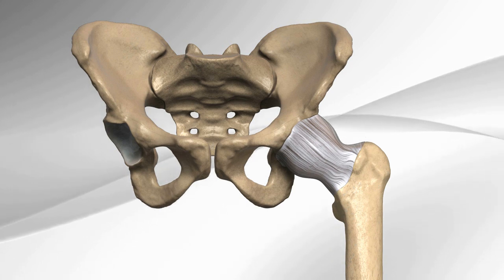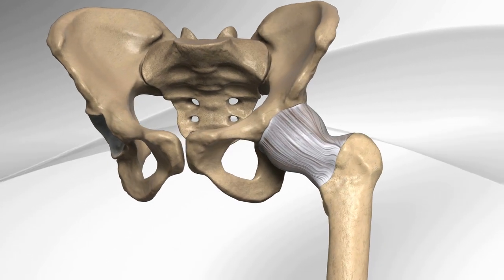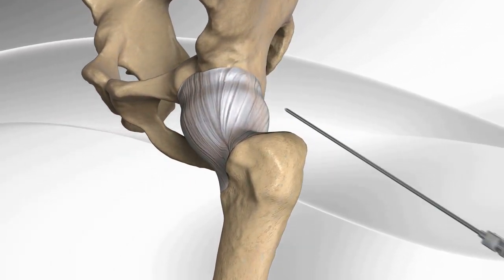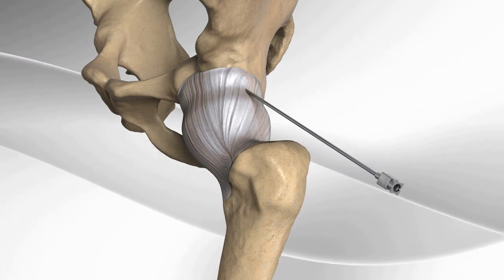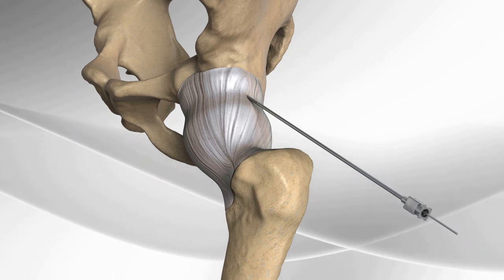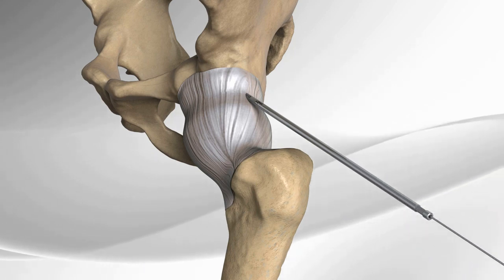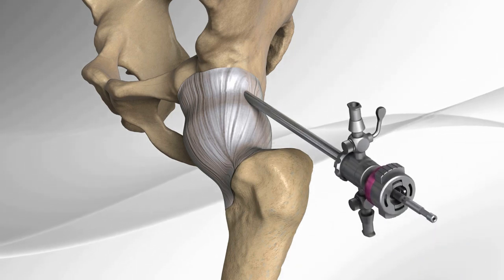The surgeon begins by placing the affected leg in traction to create room between the ball and socket. A needle is placed inside the joint under x-ray guidance and a guide wire is introduced through the needle. The needle is removed and a metal dilator is passed over the guide wire to create a track into the hip. A small camera is then placed into the hip joint over the guide wire.